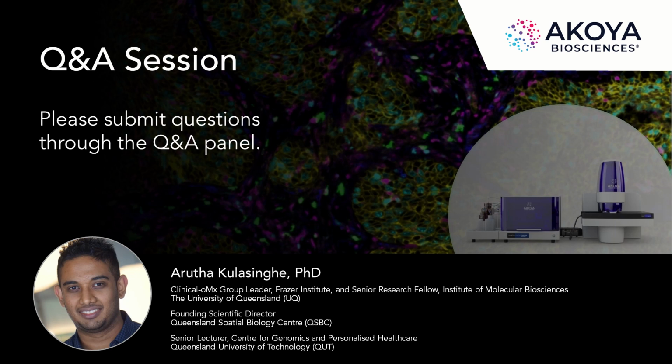Fantastic. I think in a similar vein, how do you differentiate between the normal germinal center's lymphoid structures and the tertiary lymphoid structures? Yeah, I wish I had an answer. No, it's a really good question. For us, the first step is we get the H&E, we get that annotated by a pathologist. We sit and we go through those individual H&Es that are path annotated, and we get the pathologist to annotate, where are the normal germinal centers, where are the lymphoid-like structures, where are the TLS-like structures, where is the tumor.